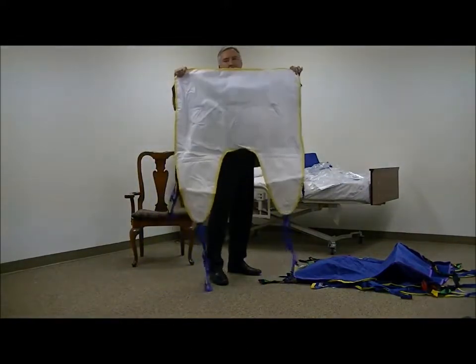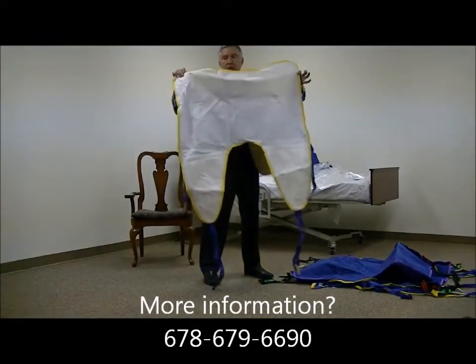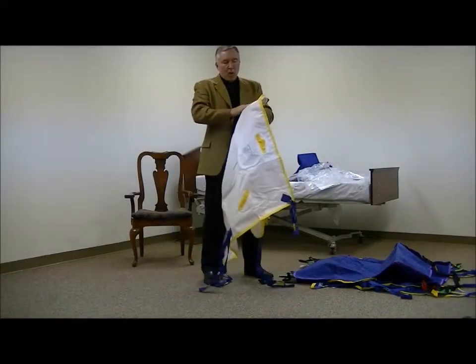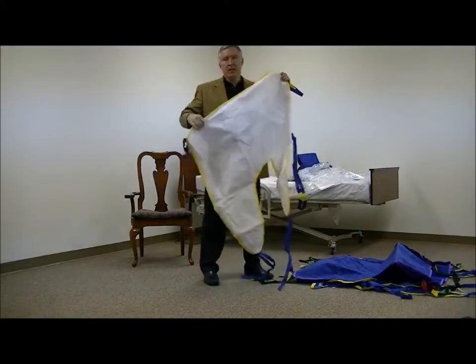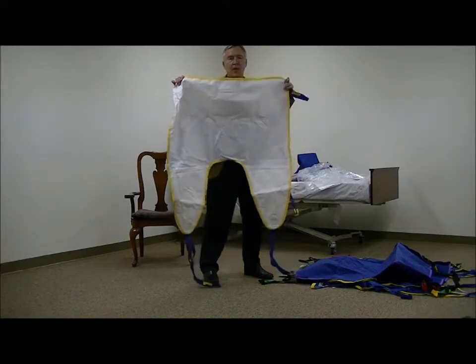So this method eliminates both of those concerns. These slings are not that expensive and most people would prefer to have their own. They can be spot washed — they can't be put in the laundry for washing, but they can be cleaned. And many times these can last months before they get to the point where they need to be replaced.